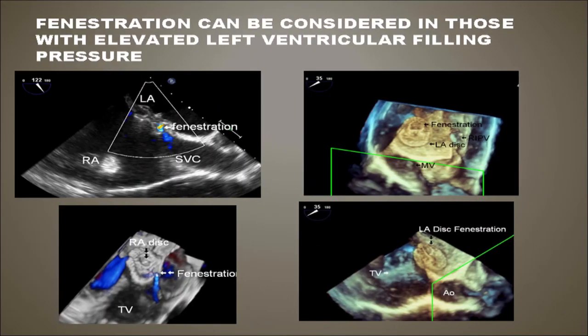So what I did with this is I took the device and I fenestrated it. It's a very refined technique of essentially stabbing the device with a dilator, creating a hole that over time may close. But you can see that the fenestration here is relatively large. There's flow here through this fenestration. Unfortunately, let's see if this will play. Yeah, couldn't get it to play. But be that as it may, the left atrial pressure was no higher after the ASD closure with the fenestration of the device.